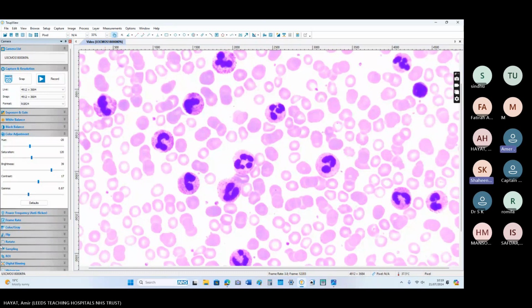So the patient was septic. At this point, with this history, would you mention investigation for CML? No. This patient is just septic, so you have to send the sepsis related investigations. You haven't seen any basophils here, myelocytes here, any blast here, or the myeloid peak here, and you're not suspecting CML. So there is no need of doing CML investigations, and no need to do investigations for CNL.